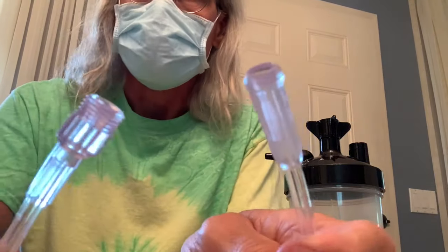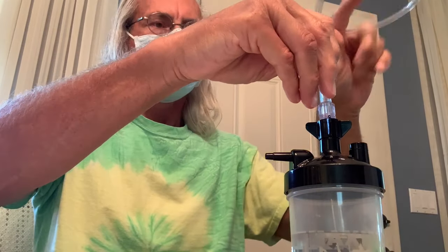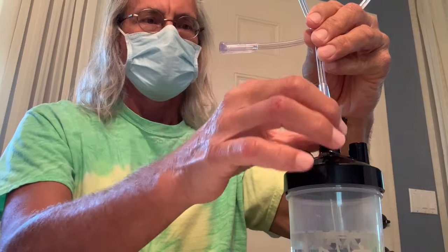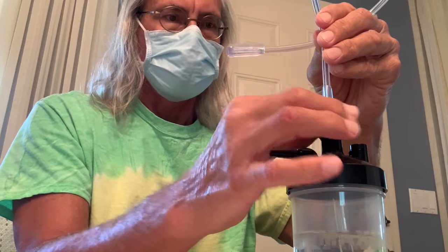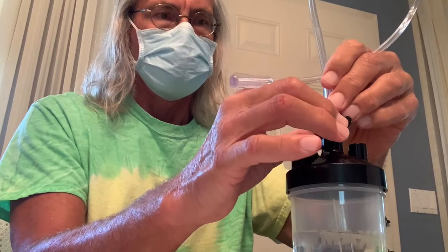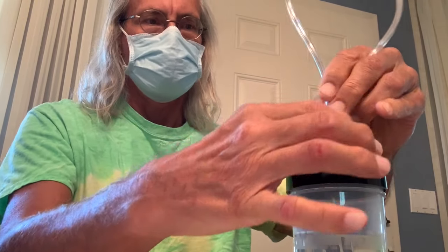We pull that connector out and the one side goes into the actual oxygen concentrator. We're going to screw it right in there — twist it down with the other hand and tighten it up. Be careful not to cross-thread it. You want a good seal, so get it on there properly. Then we take it over and put it on the velcro strap area on the oxygen concentrator.